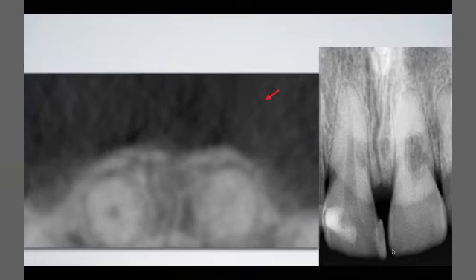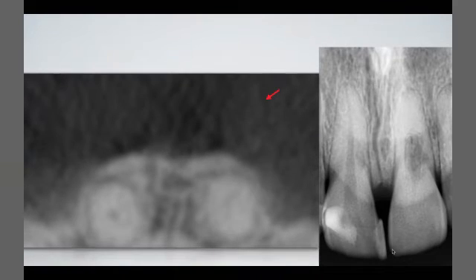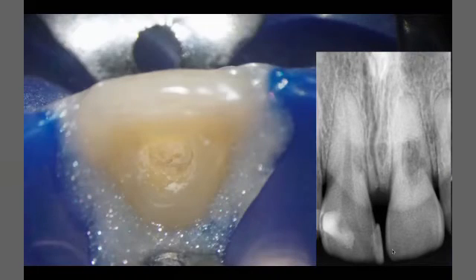That's why we can do the normal root canal treatment and the filling, maybe with gutta-percha and sealer, because there is no connection with the periodontal tissue. When we have a connection, we can do the operation with another biocompatible material, MTA, Biodentine, or bioceramics.